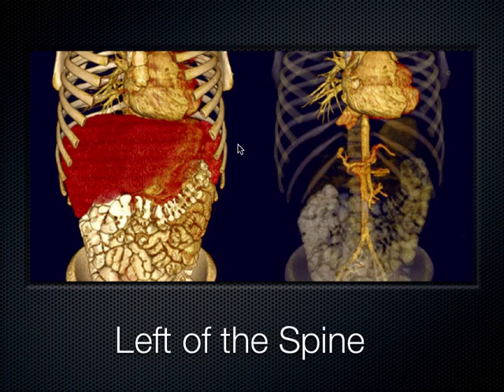This is a really cool CT scan, 3D renderization with the organs on, with the organs off. Very cool technology, I agree. The cost of 500 chest x-rays and radiation. Here is the aorta coming down the left side of the body, correct? Here's the heart. After it comes out of the chest into the abdomen, that's when you can see it. You can't see it up here in the chest with ultrasound. That's one of the limitations of ultrasound. You can't see a thoracic aorta, but you can see the abdominal aorta very, very easily. You just keep pushing down until the spine shadow comes into play.